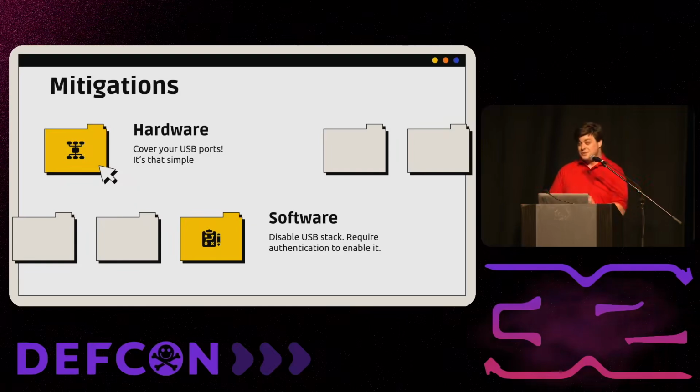If you do need them for maybe service or something like that, then disable the USB stack until the user does something explicit: until they want to export a report, until they say, hey, I need to flash new firmware on the device, or hey, I'm a service tech and I've logged in with my special service tech password, right? Don't just have it open all the time, only have it open when you need it. And that's a much smaller attack surface than just someone being able to plug it in whenever they want.